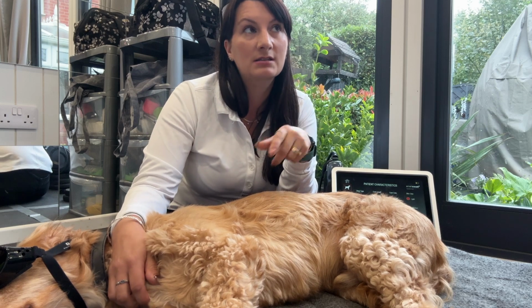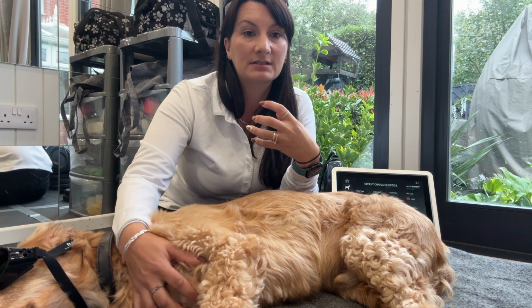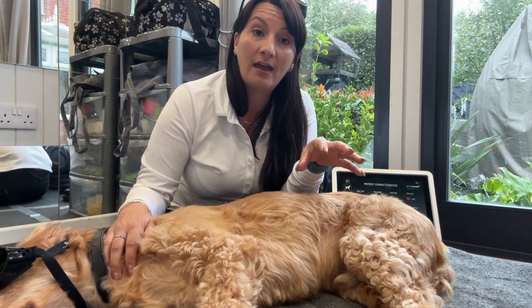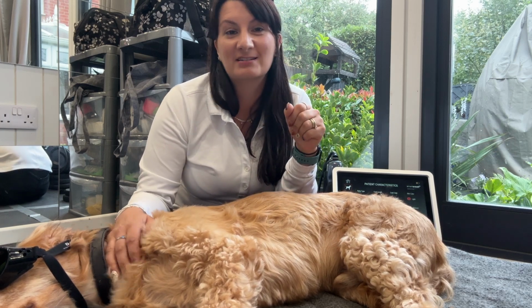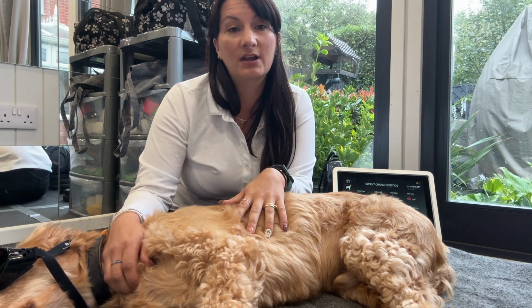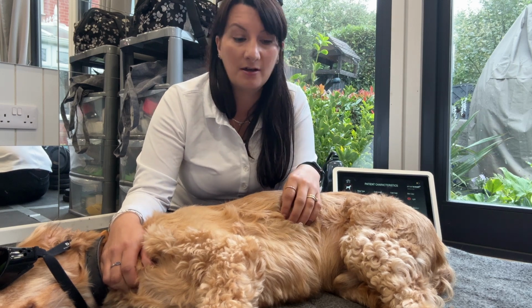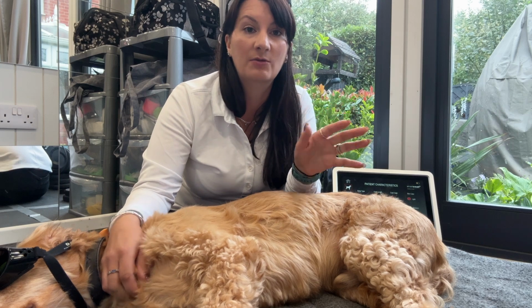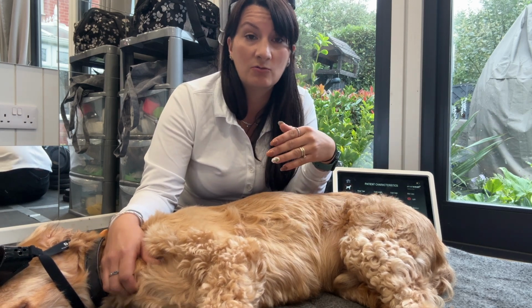The other side though is, some people will argue, well, I use my own settings, I calculate my own doses to be, again, as successful as possible. The thing you have to be careful of there is, we're very good at saying, right, the dose is 2 to 8 joules per centimetre square for this condition. Well, that's great, but that's not taking into account, again, coat colour, skin colour, coat length, muscle and fat density, and all those lovely other things that we need to think about. So there's no right or wrong way, whether you use presets or whether you want to calculate your own.